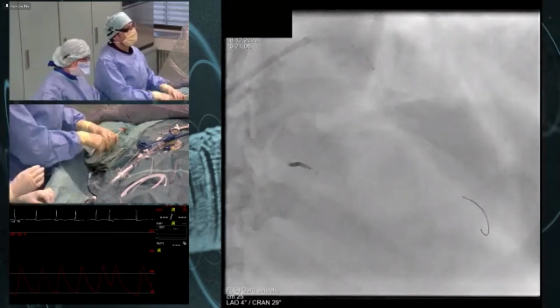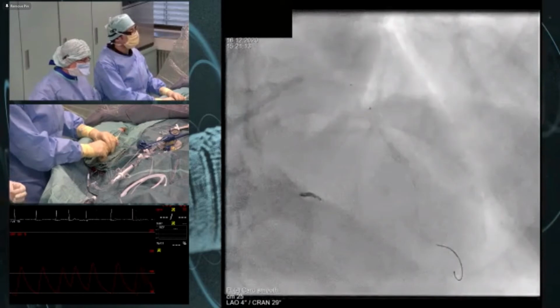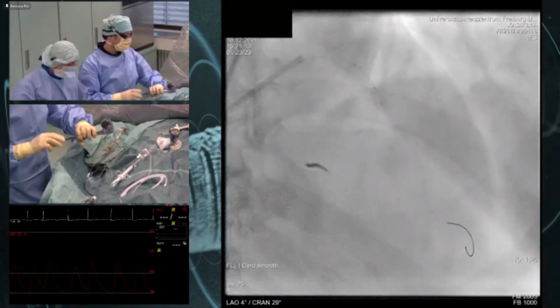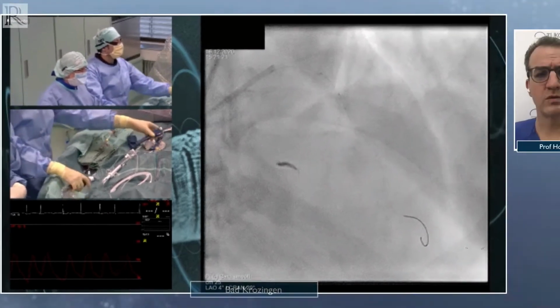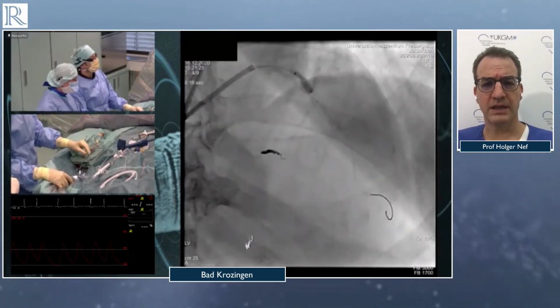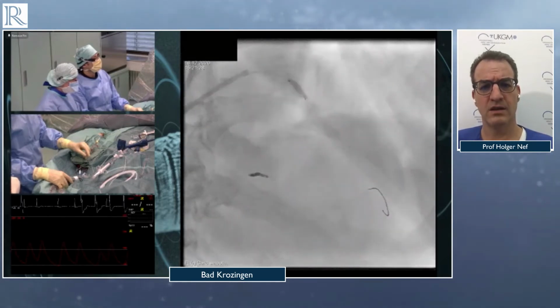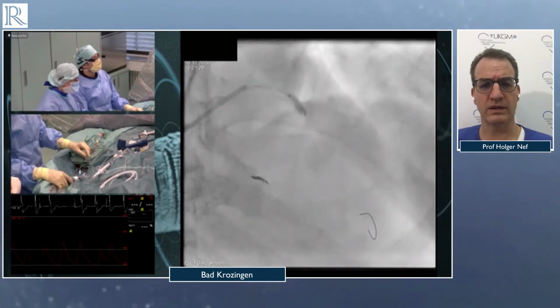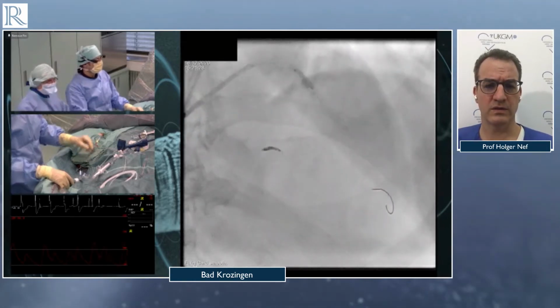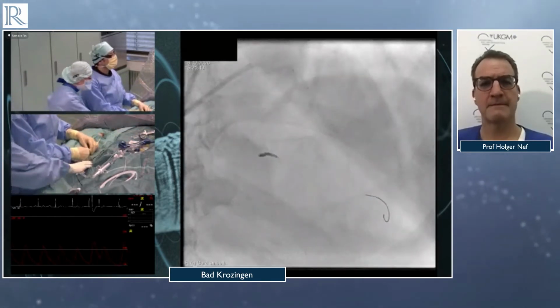And we don't need more. Then we use the rest of the 70 shocks for the eccentric calcification. We go a bit back, and now we will use all these possible shocks to prepare the lesion perfectly. Normally the company told us that we have to give 2 cycles of 10 pulses each for one segment. So now you only used 10 pulses. That's correct, it will be better to do this twice, but let it stay in position.